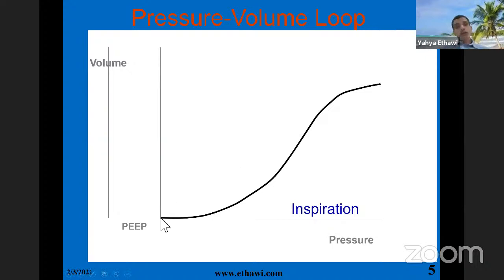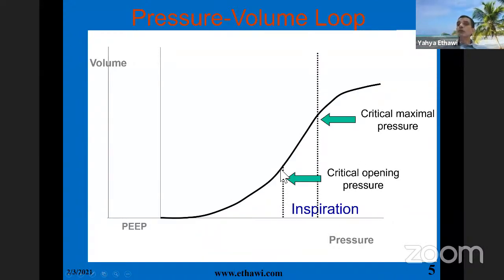You can see the ventilator started from the PEEP and the pressure is increasing, but with minimum volume, until we reach a point where a minimum change in pressure gives you maximum change in volume.